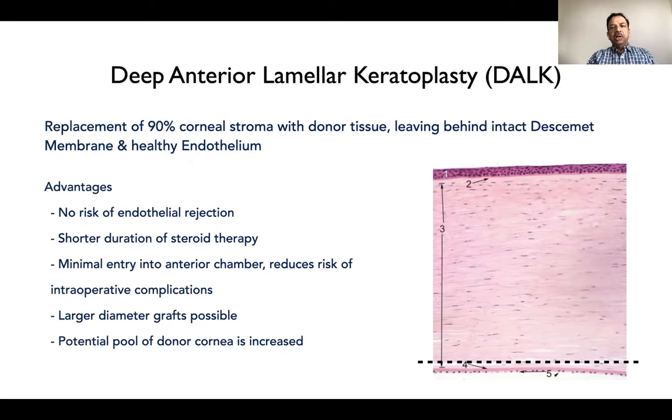Deep anterior lamellar keratoplasty, or DALK, refers to a surgical technique where 90% of host corneal stroma is replaced with donor tissue, leaving behind intact Descemet's membrane and the healthy host endothelium. The major advantage is there is no risk of endothelial rejection. You require steroids for a shorter duration, thereby avoiding complications like steroid-induced glaucoma or cataract. You can do much larger diameter grafts without the risk of rejection, and you can easily obtain tissues from the eye bank.